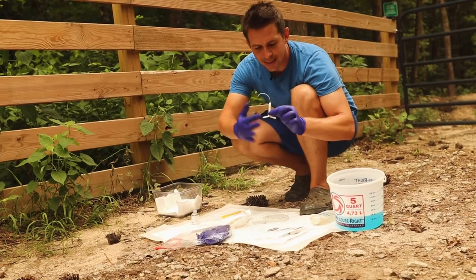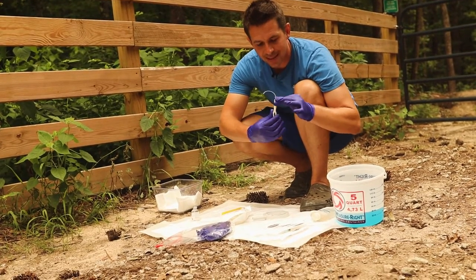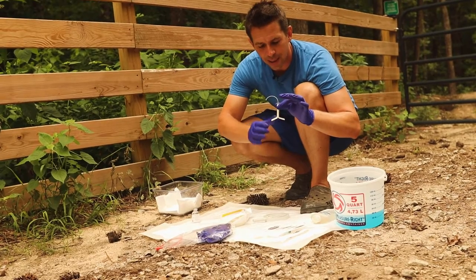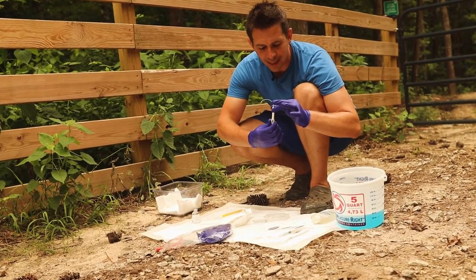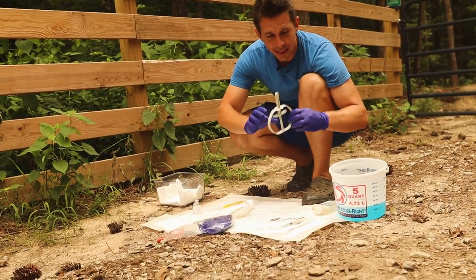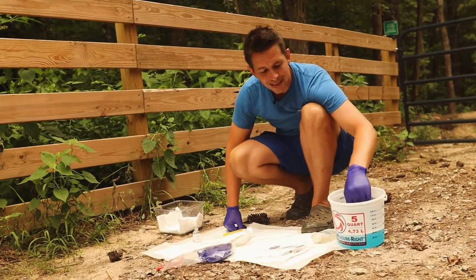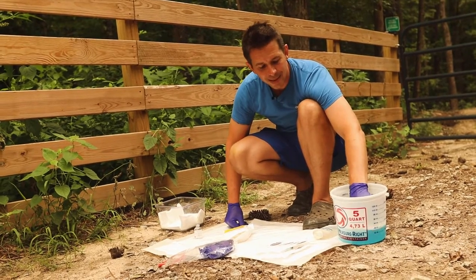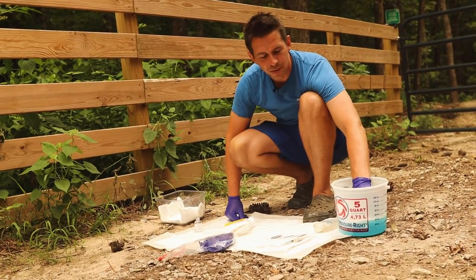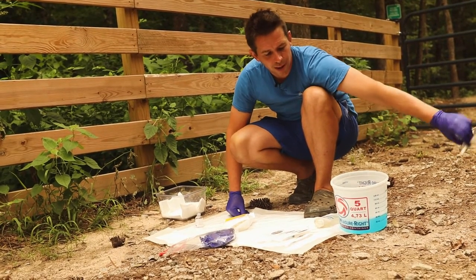What I have here is a CIDR, and these things have a wing on the side of them. These wings, whenever we release it inside the goat, are going to spread out to hold it in place. I'm going to fold these down whenever I stick it in the applicator. Now this applicator gun is going to go inside the goat, so we do need to make sure that this is sterile. I have here a bucket of chlorhexidine — it's just a good safe sanitizer. You'll see this used in dentist offices, doctor's offices, vet's offices.